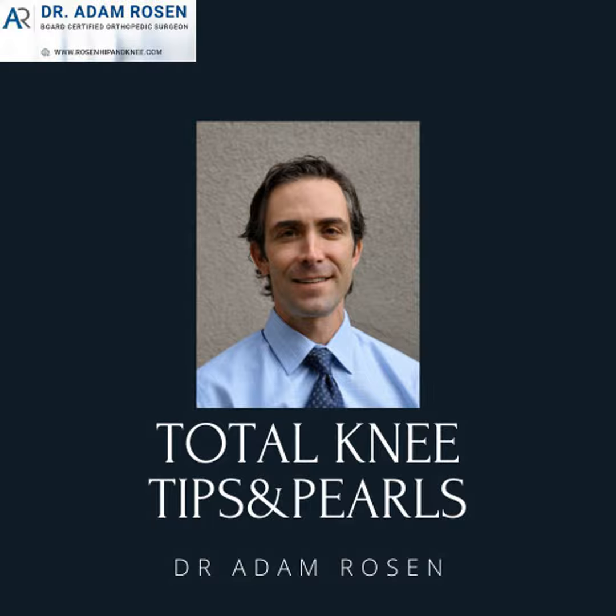I don't want to cut through scar and then worry about drainage because I'm trying to get scar to heal back to scar. And because it's a revision, I always make big incisions. There is zero reason, in my opinion, for you to struggle during a revision. And lo and behold, if you start with a small incision, notoriously you have to lengthen it throughout the case.